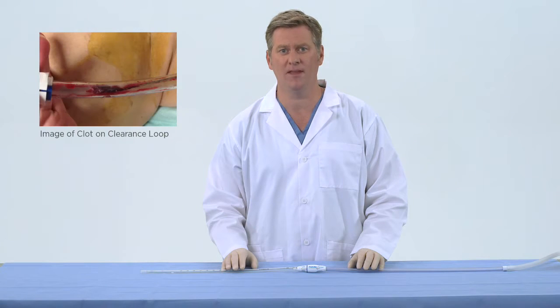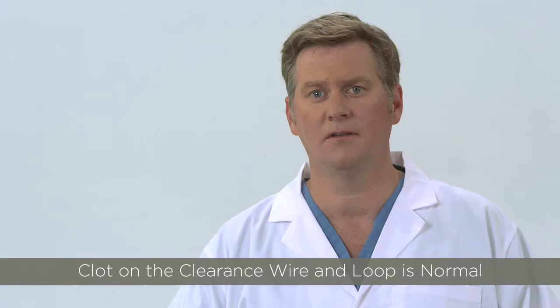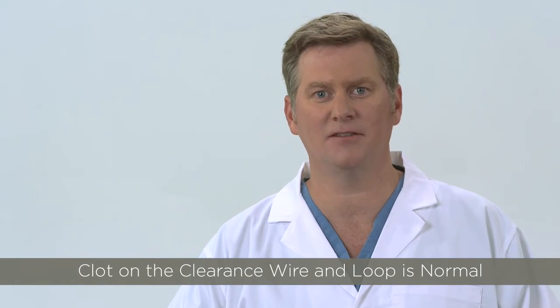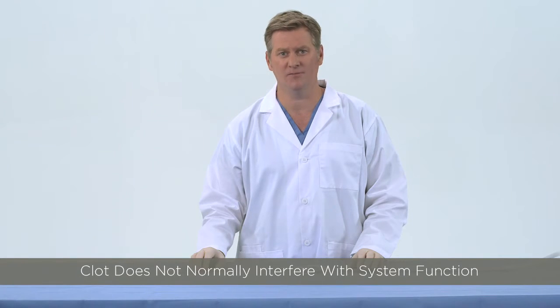In the process of clearing a chest tube, clot will be removed and may be seen adherent to the clearance wire and loop. This is normal and should be expected during the post-operative bleeding period. The buildup of clot on the clearance loop does not usually interfere with normal drainage to the suction canister.